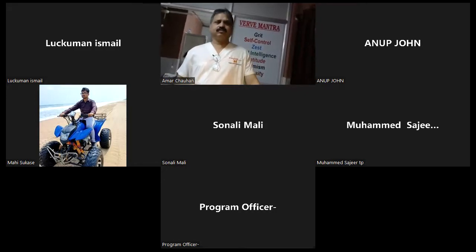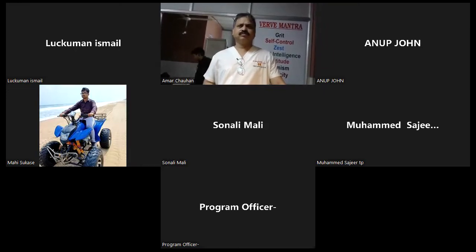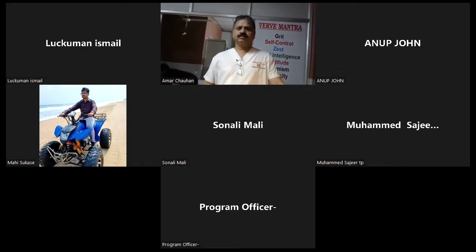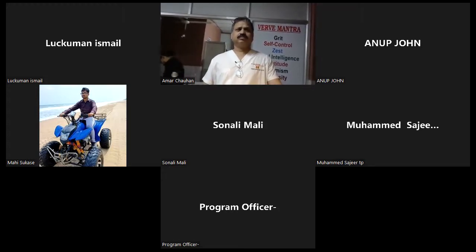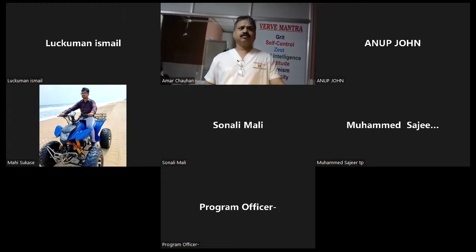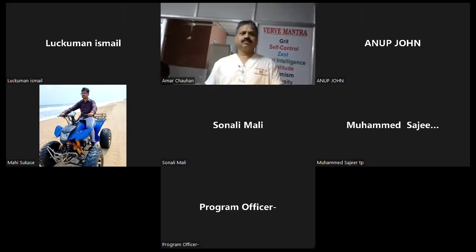Now, how will the certification of aesthetically designed exact landmarks be done? By looking at it itself. I'm saying there should be some kind of certificate. We just want some light from this demonstration, that's why we are asking. For this anatomy model there is no such certificate; it's about realism, it should look like an anatomy torso. That's all.